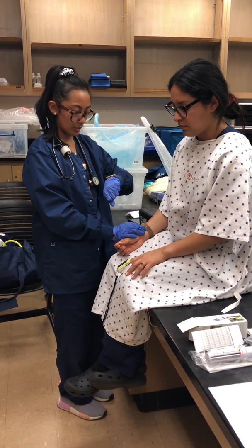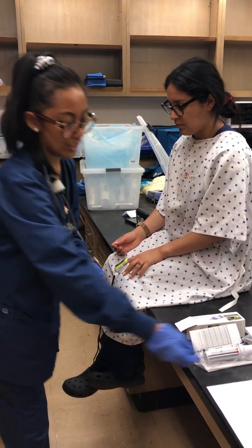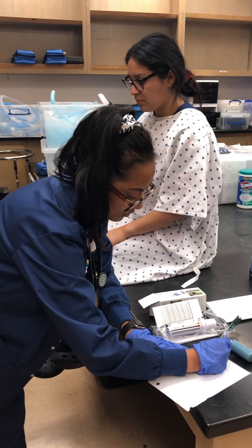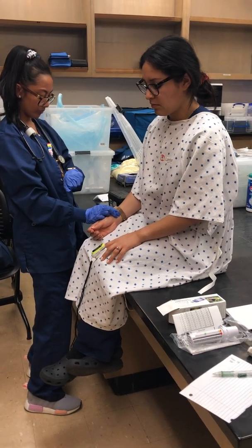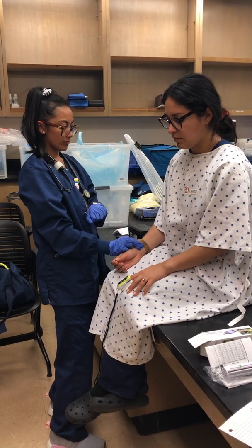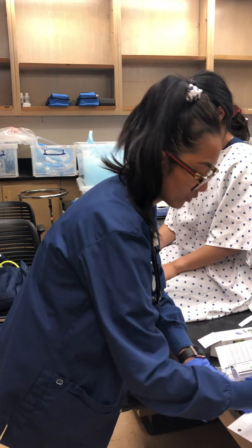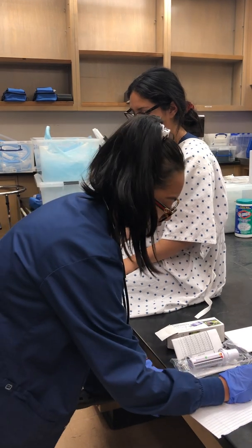Okay, so for the pulse, I got 44 for the 30 seconds. I'm going to multiply that by 2, and it gives us the 88 for her pulse. And respiration. I'm going to double check your pulse one more time, okay? Okay, so for her respiration, I did get 7 for the 30 seconds. I would multiply that by 2 again for the full minute, and I would get 14. Her O2 is at 99 on her pulse ox.